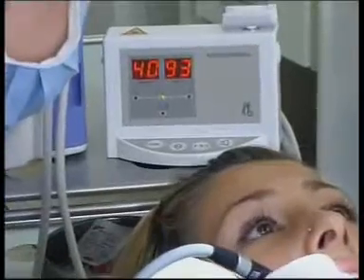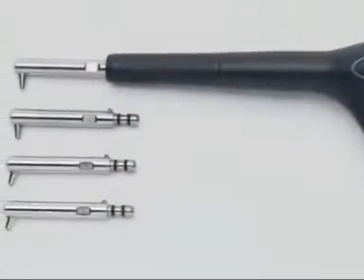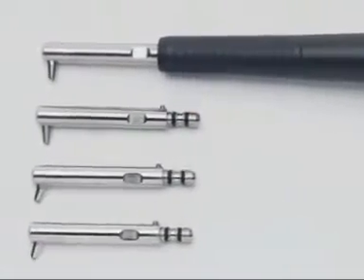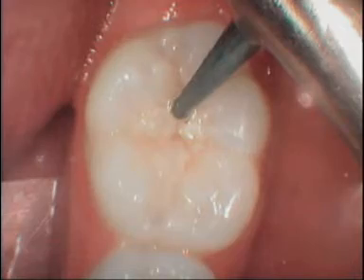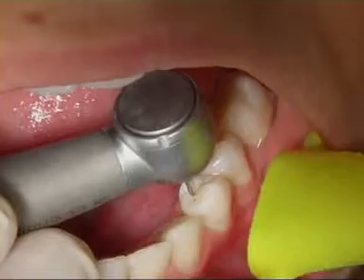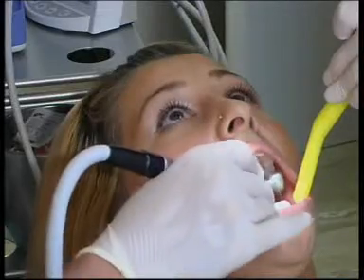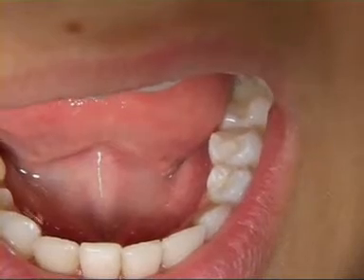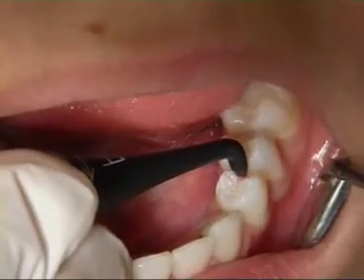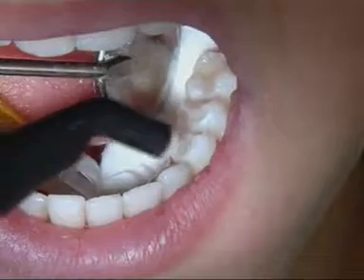Because caries has already penetrated further into the fissure, the fissure is first extended using, depending on the individual situation, a Kavo Rondoflex air abrasion instrument, the SonicFlex system or, in the advanced stages, turbines and a fine diamond burr. The second measurement confirms that microbial activity is below 10, meaning that fissure sealing can go ahead.